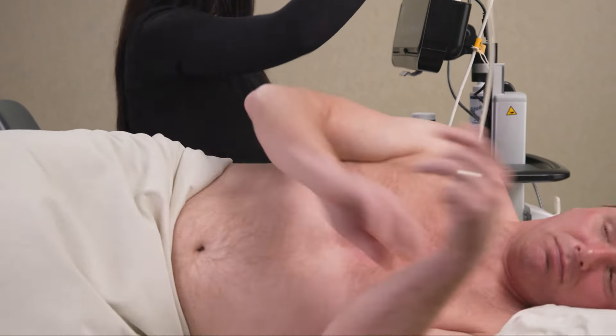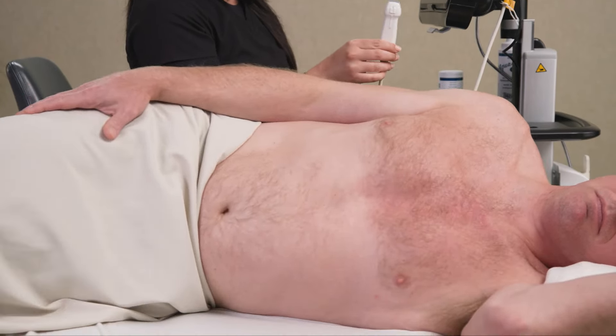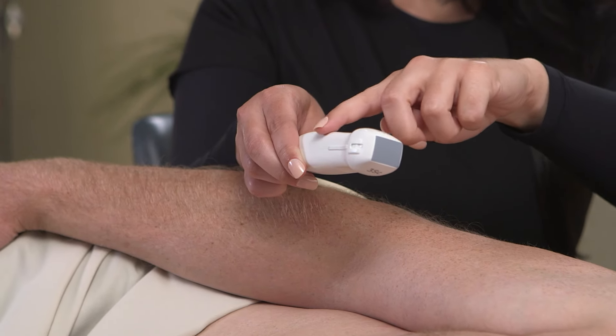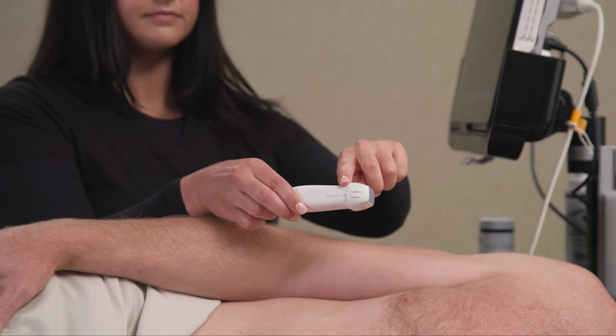Now that you are in the correct starting position, you are ready to begin scanning. On your ultrasound probe, locate the indicator. This may be a notch, bump, or even a color marking on the probe. Knowing where your indicator is is critical to capturing an echocardiogram.